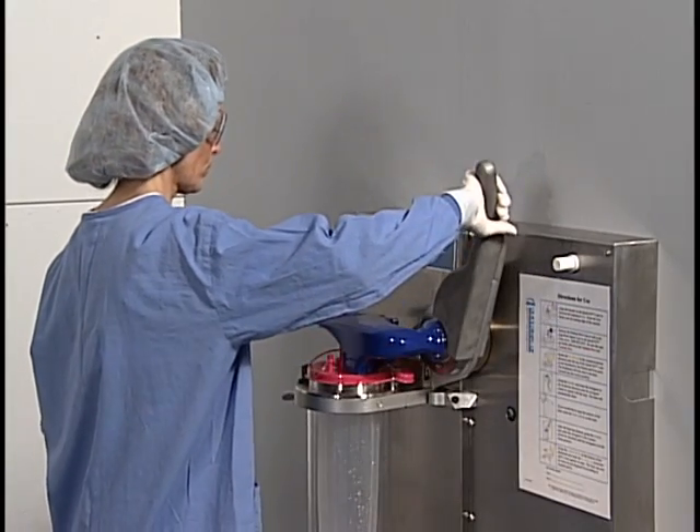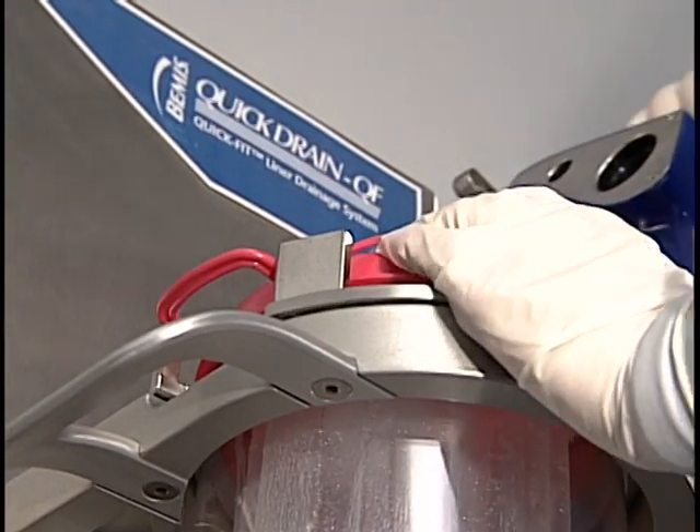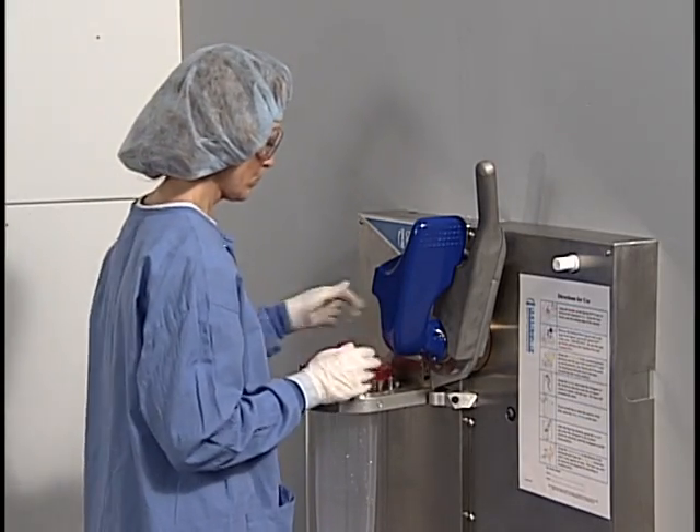To remove the liner, press the release lever, which you'll find on the bottom of the drain head, while holding the top of the canister with your left hand. Lift the drain head until it hits the stop. Recap the patient port and pour spout and remove the liner.